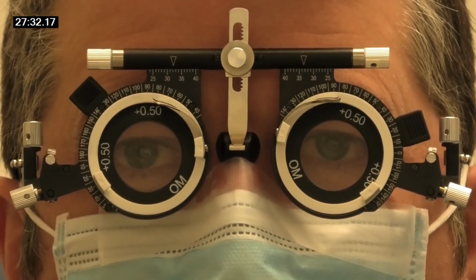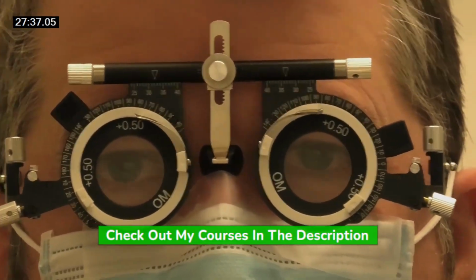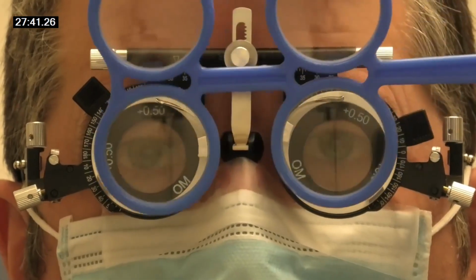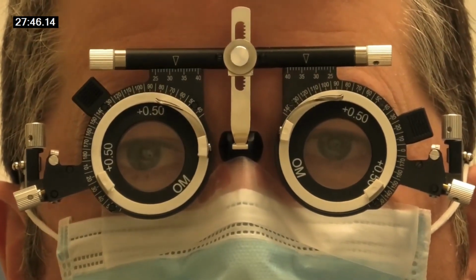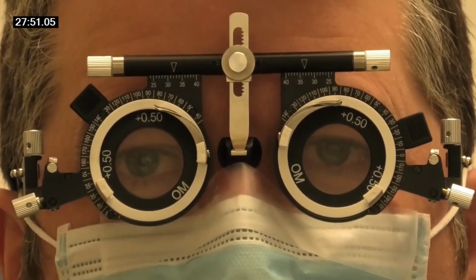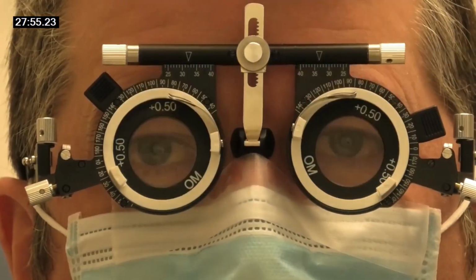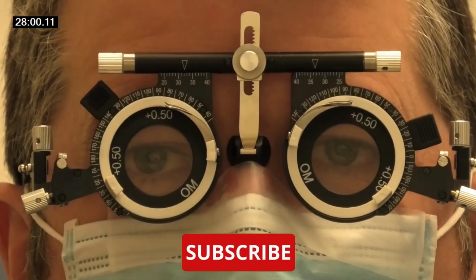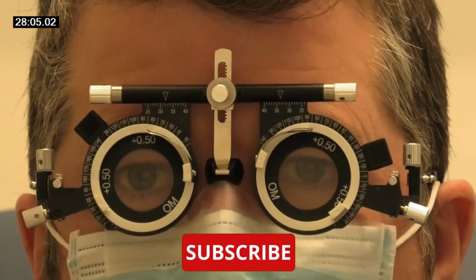Okay, so what's the smallest line that you can see? The bottom line again. Okay. And does that look clearer with that? No. At this phase it's not clearer. Okay, so it's either the same or worse. Yeah. So let's do that again. So is that the same or worse? It's worse. Worse. Okay. Good. That's what we want. So that's the maximum plus now, isn't it? Okay. That's all. So that's our answer. Yep.